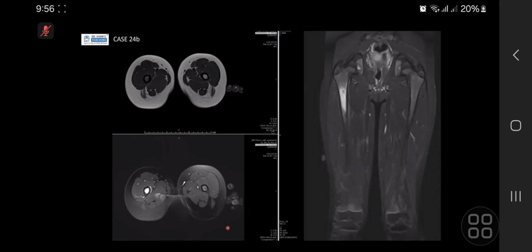No, I can't think. Okay, so are you quite confident? Are you going to tell them that's it, we're going to leave it alone, we're not going to do anything more, or are you going to say, I want to do more stuff? You can choose to repeat imaging. You can choose to do another scan, a different modality. What will you do next?